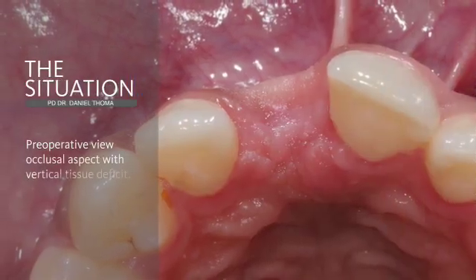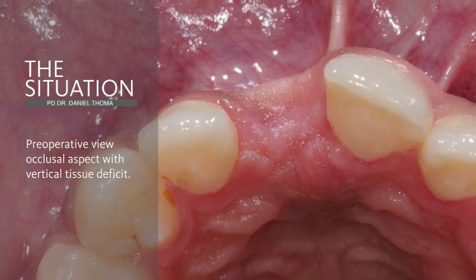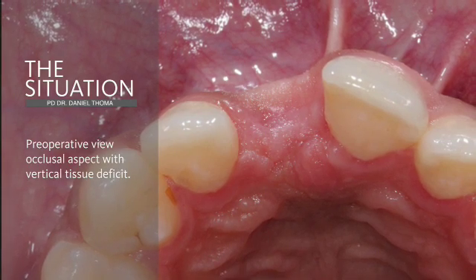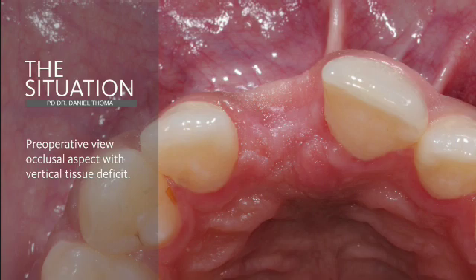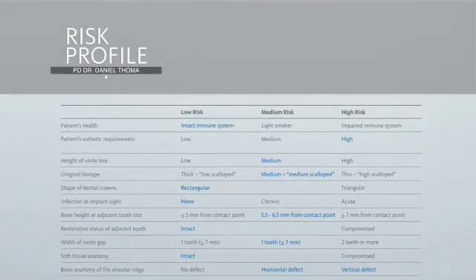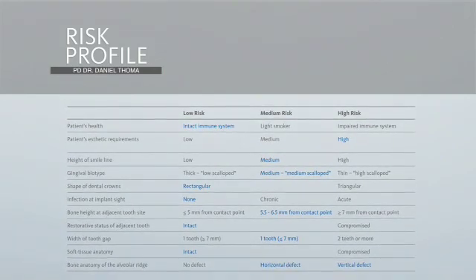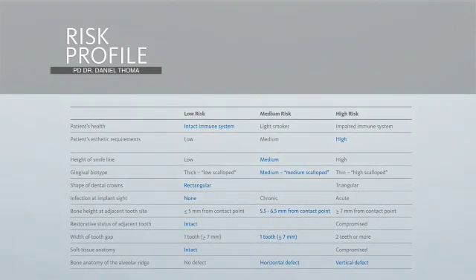Upon clinical examination, severe horizontal and vertical contour deficiencies are present, and a decision was made to perform a soft tissue grafting procedure. The risk profile illustrates that the patient is healthy. He has high aesthetic requirements, a medium-high smile line, and a medium scalloped gingival biotype.